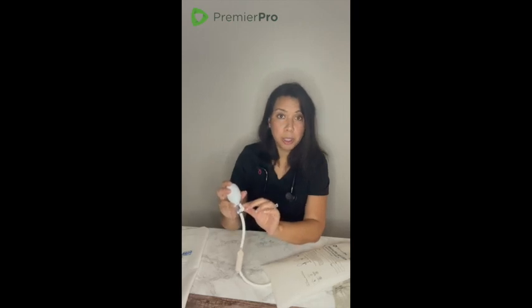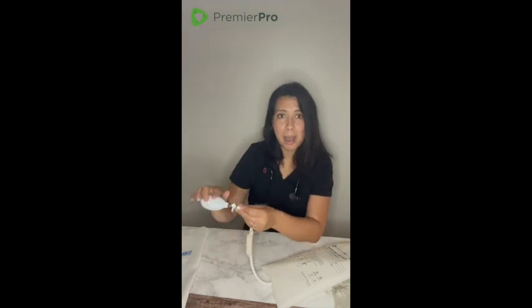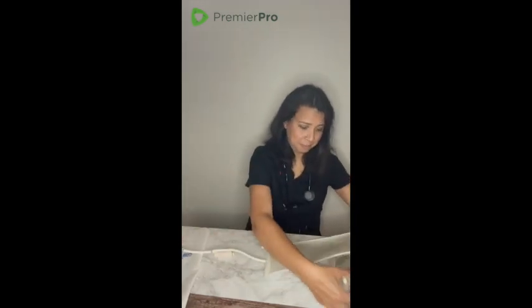It has off printed on the tail, and I'm going to simply turn it so that the off wording on the tail is now positioned directly over the pressure release valve. Now I know my bag is ready to inflate. I'm going to go ahead and load my IV bag.